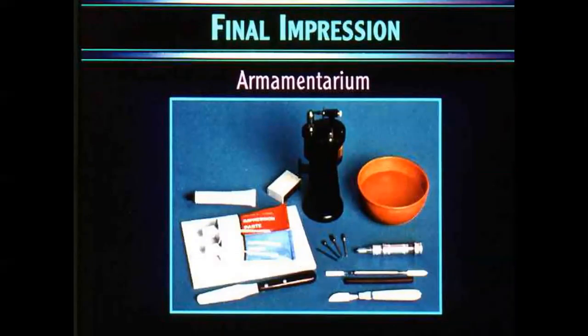Here we have the pastes of the final impression, base and catalyst. We mix them with this spatula, this straight spatula, not a curved spatula.